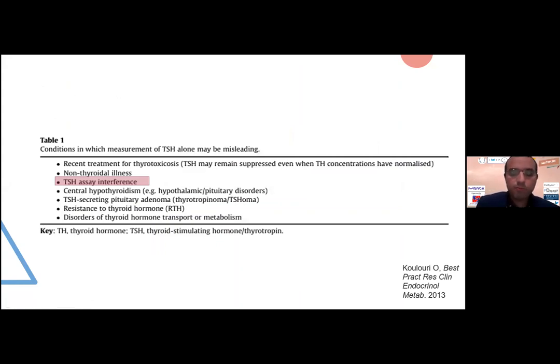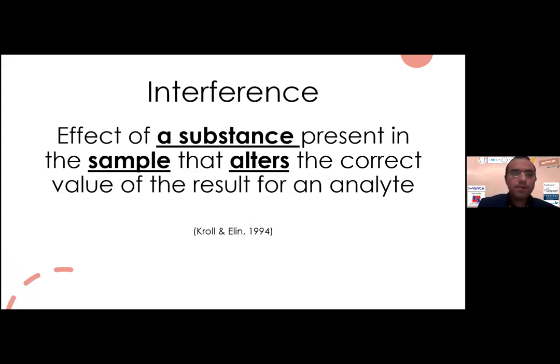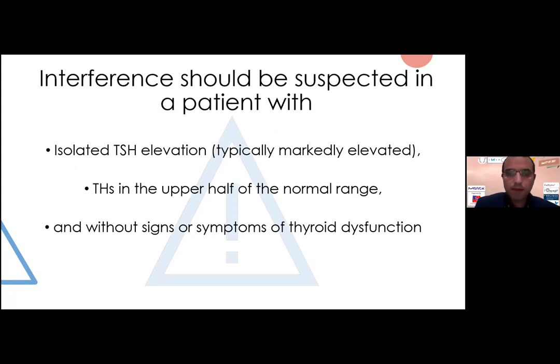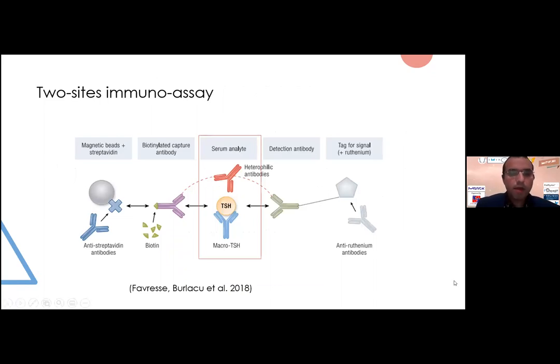There are some conditions in which measurement of TSH is misleading, and one of these is TSH assay interference. We've heard about central hypothyroidism, TSH-secreting pituitary adenoma, and resistance to thyroid hormones at this conference. Interference is the effect of a substance present in the sample that changes the correct value of the result for an analyte — here the analyte is TSH. Interference should be suspected when TSH is very high, FT4 and FT3 are normal, with FT4 in the upper half of the normal range, and there are no symptoms or signs of thyroid dysfunction.